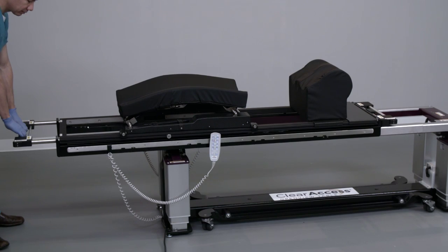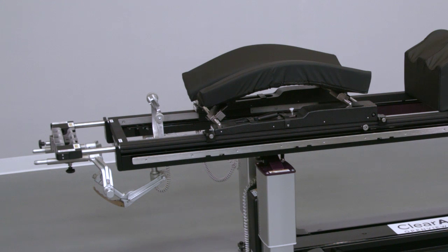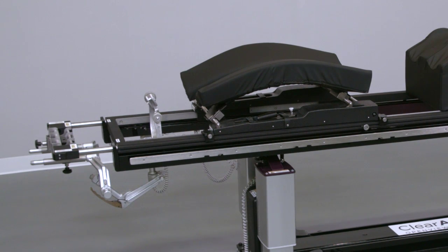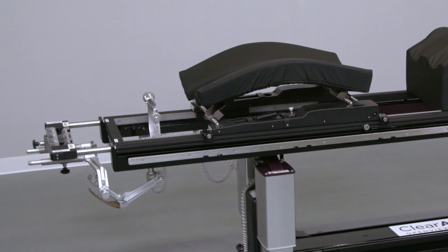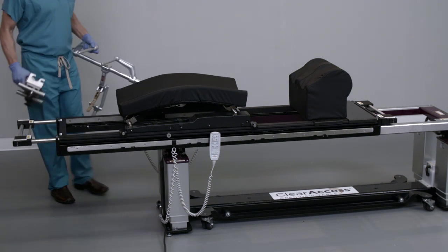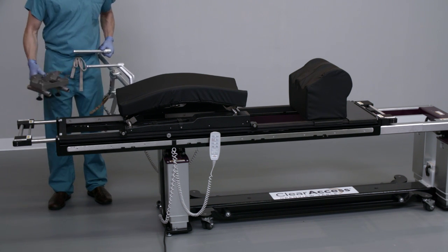Next, obtain the OR Safety manufactured cranial stabilization adapter and the institution-owned Mayfield or other manufacturer cranial stabilization base unit. It's necessary to install the base unit into the cranial stabilization adapter before installing both onto the table. To join the two, hold the cranial stabilization adapter with the 3 black knobs pointed downward and the single black knob pointed away from the base unit.